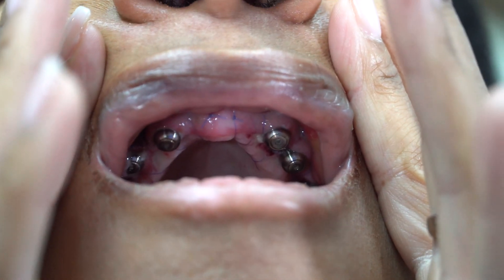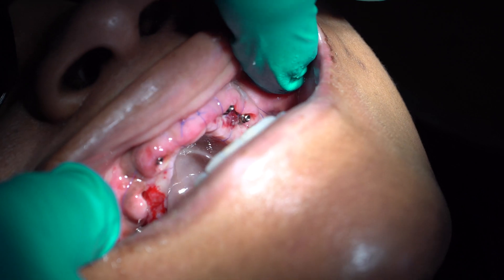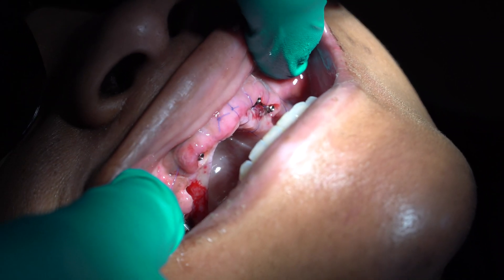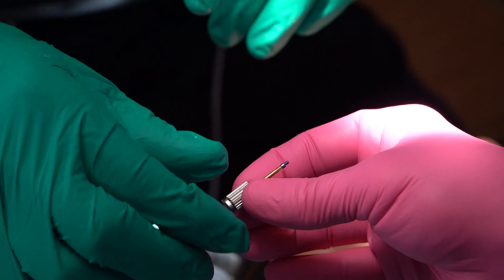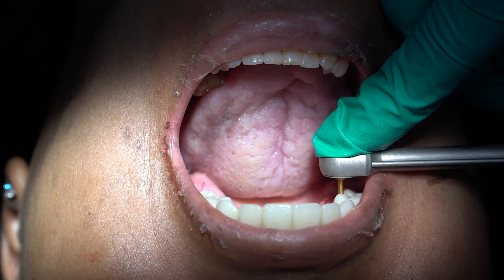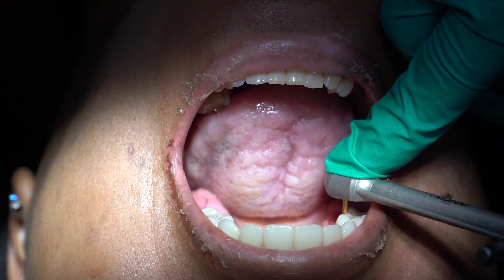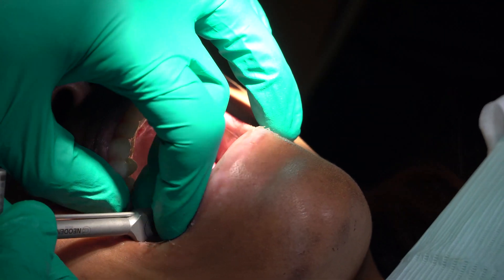Very minimal pain, very little discomfort. Other than talking minimally, I've just been resting, haven't had any pain at all — thumbs up. When the prosthesis came back, all we really had to do was screw it in place, practically no adjustments. All that needed to be done was to dust off a few of the line angles so that the patient could occlude appropriately into the CR position.